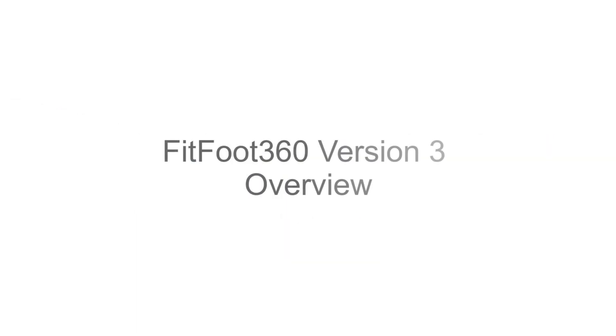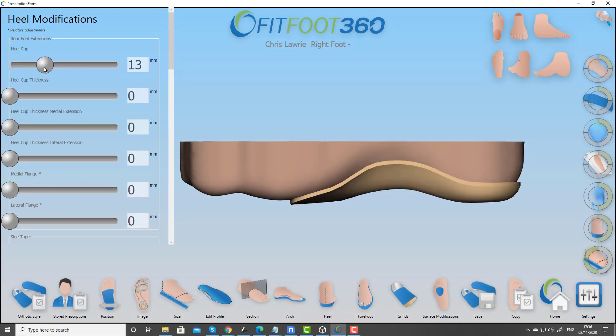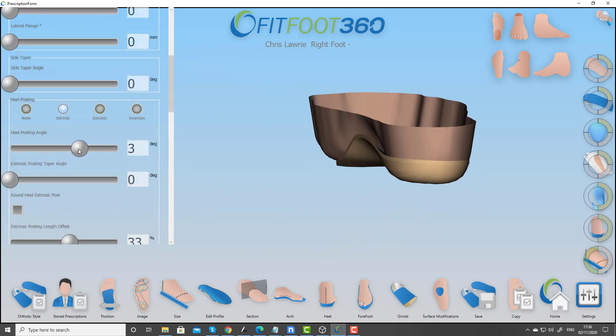Fit360 are pleased to announce the release of a new version of our Fitfoot 360 software, version 3. As always, clinical control and patient outcome remain our priority, but we also like to add features for 3D printing and for milling as well.